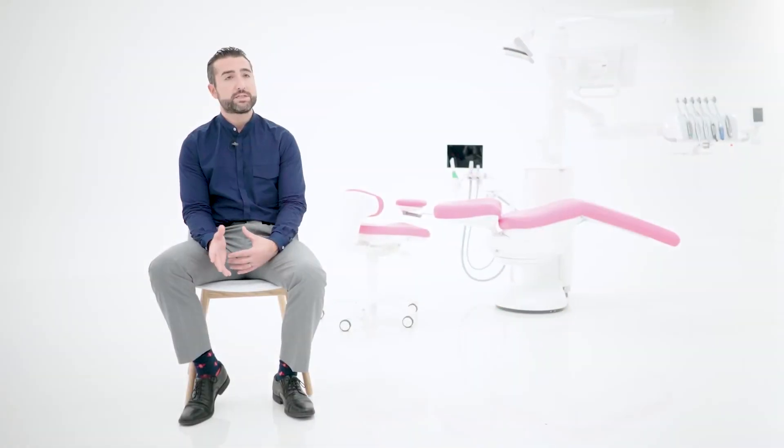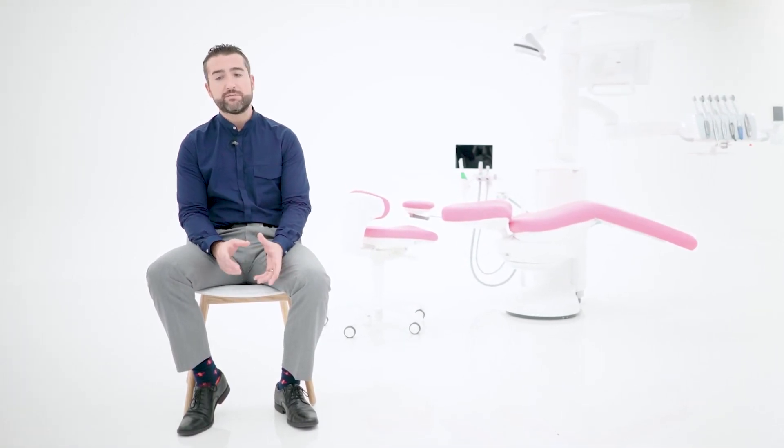There are no limitations to what you could do with intraoral scanning. I do full mouth reconstructions with it, all your big implant cases with the final impressions, and diagnostically I have a patient come in and take a baseline scan. Because it takes under a minute to scan a full arch, why not just take digital records of where that patient is in time?